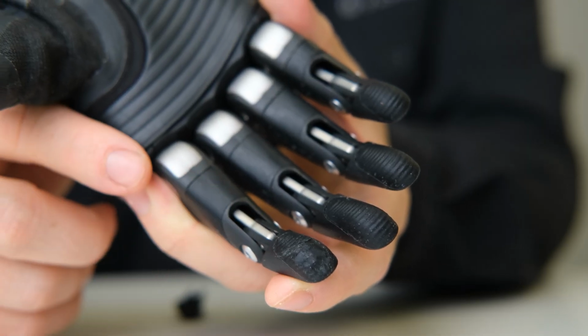Grip tips should be replaced when they're worn out or you feel like the gripping surface is not as good as it used to be. This is a good example of a grip tip that should be replaced.